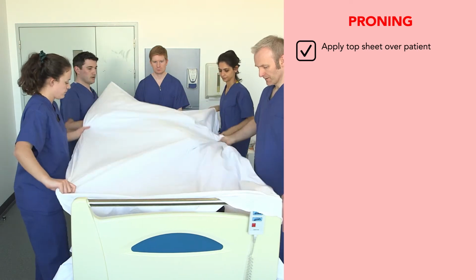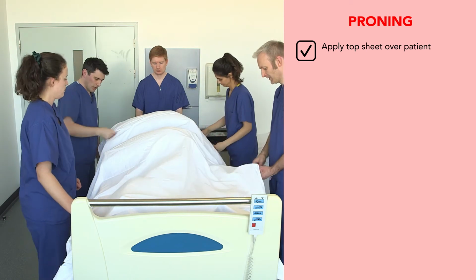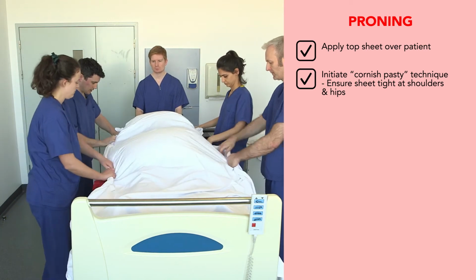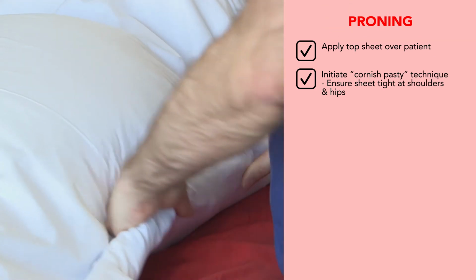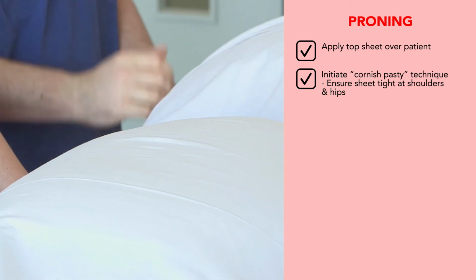Okay. And we're going to make sure there's enough length to cover the patient's head and then come back. At this point, we're going to roll both the top sheet and the bottom sheet together to make a pasty, and to ensure it's as tight as possible at the shoulders and the hips. Ensuring that there's no slack.